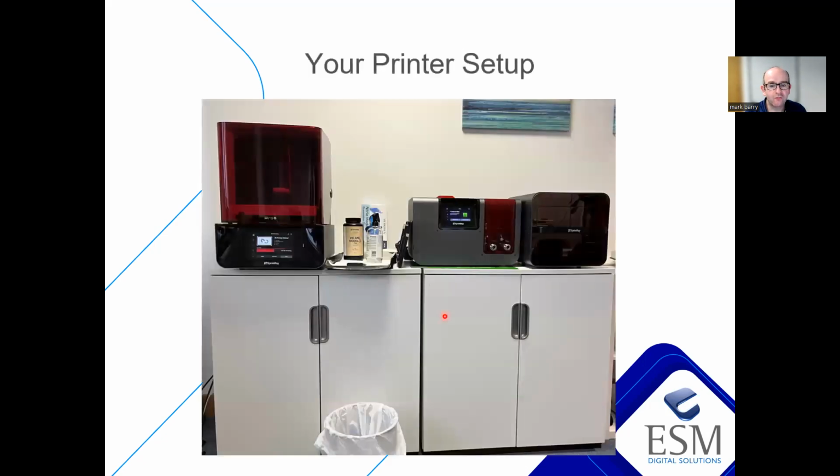Okay, let's run into a printing demonstration. So here's a photograph of our SprintRay setup in the office here. SprintRay, Formlabs have a very similar setup as well. And if you're using any other printer, you will have these, I'm going to say three hardware elements and one bit in the middle. The hardware elements are the printer, the washing unit, the curing unit.